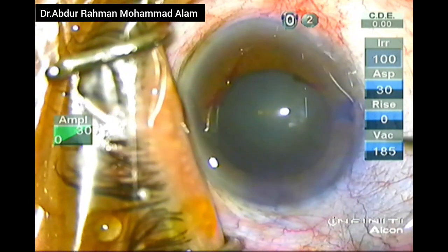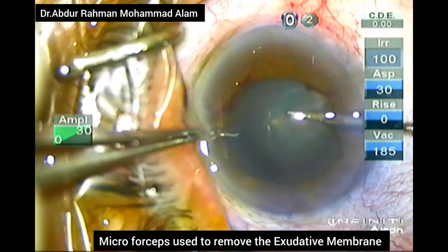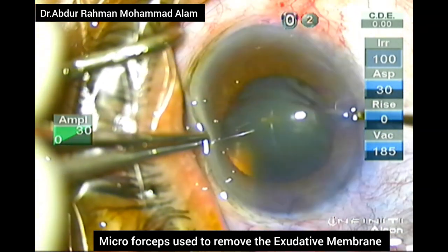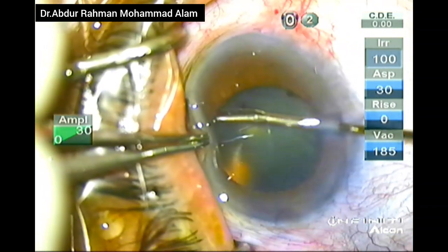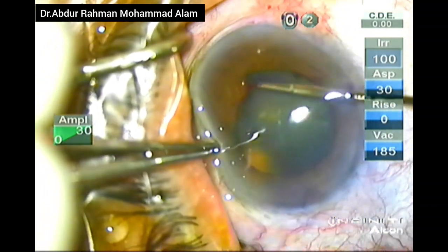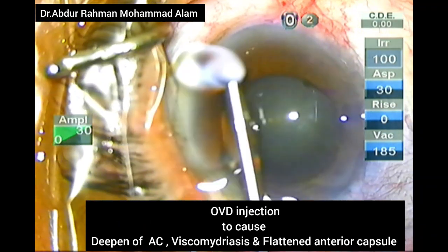Now I will be using a micro forceps to pull out the exudative membrane in a tangential manner. Not to exert too much pulling force because it can lead to iridodialysis. It can also cause bleeding from the iris and cause hyphema.